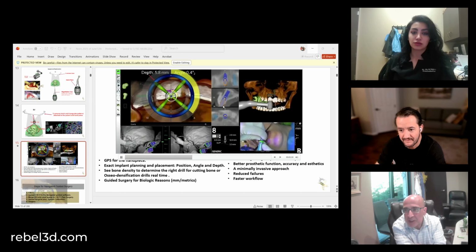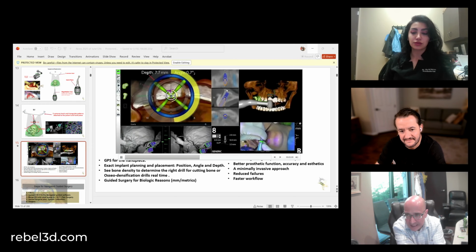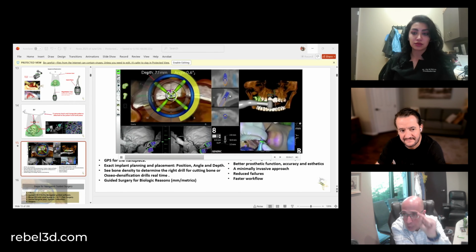Not just that. Imagine here, if it's very mushy and I need to do bicortical stabilization, right? I can see exactly where I'm going. I can knock the floor, and I see that I'm knocking the floor. And after that, I'm going with the implant and having the tip of the implant anchoring this piece at this point. You can do all that. You can even see visually where to stop.